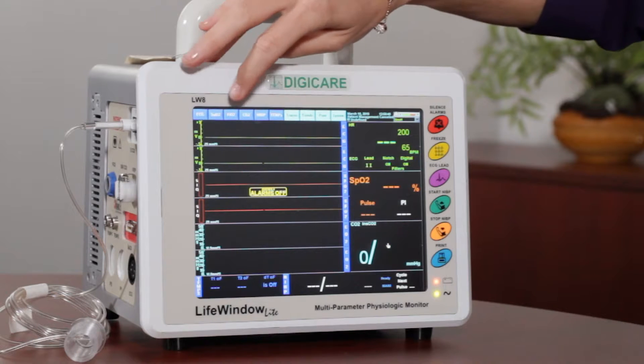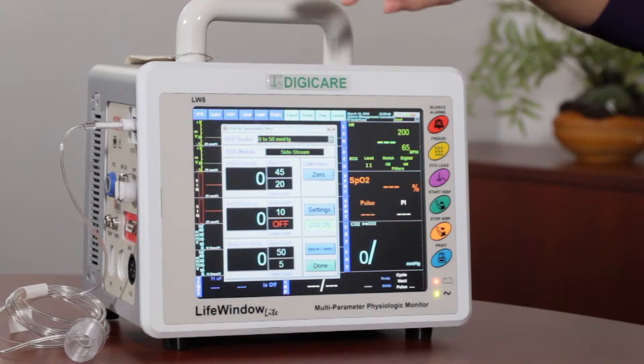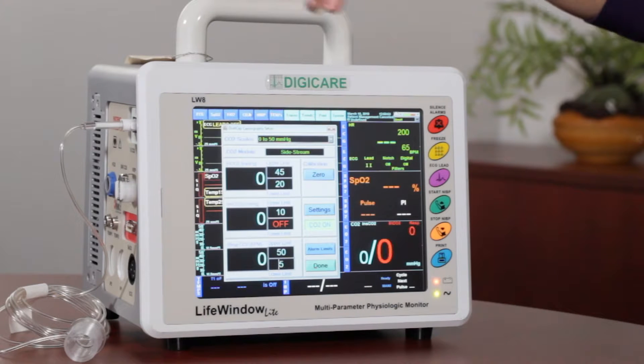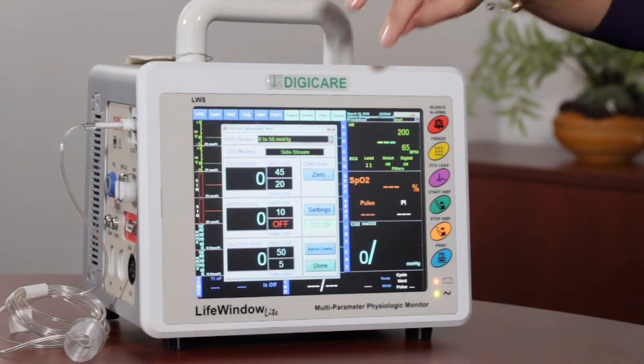Now with the CO2 side stream, when you first turn the monitor on, you need to wait about a minute to give it a warm up. And with the CO2 mainstream, you need to allow about two minutes for the CO2 to warm up. Once the CO2 is warmed up, then you can go ahead and run a zero calibration.